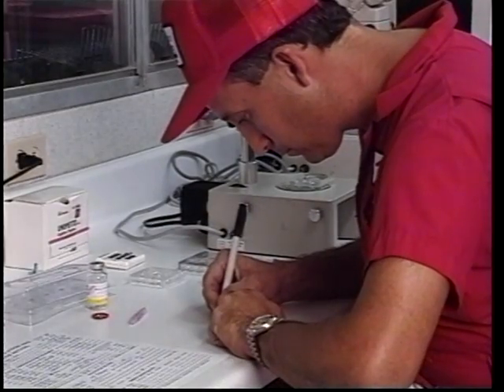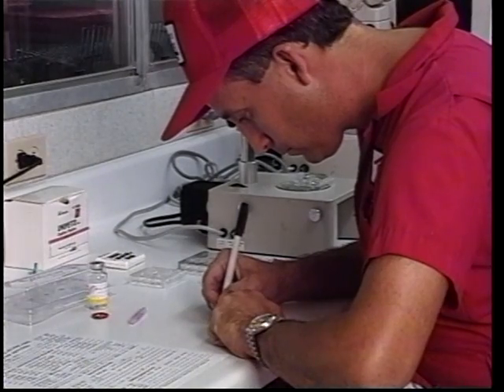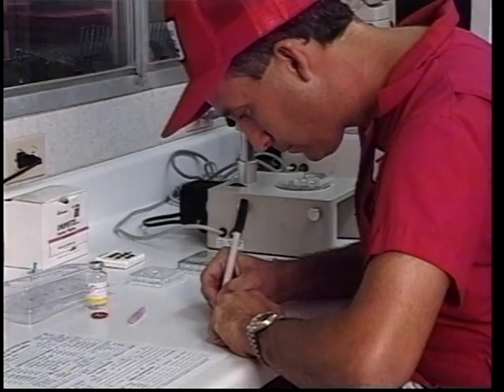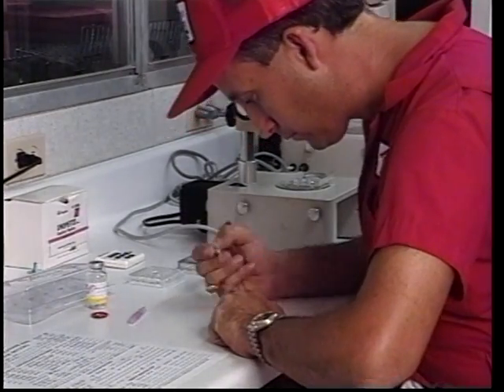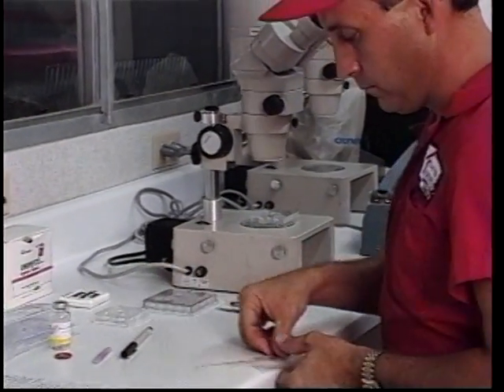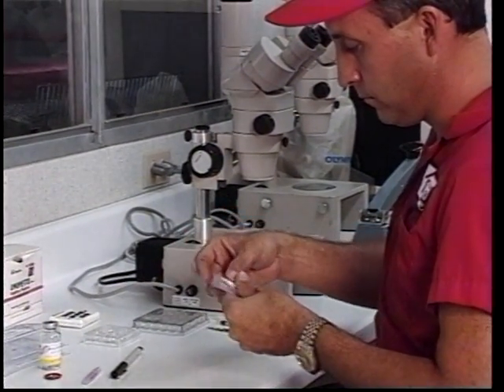All of the writing needs to be done on the cotton plug end of the straw, and on the back side, write the embryo freeze code, which identifies the particular company doing the freezing, followed by the date. With this information, we can check back upon the records and determine exactly which embryo was frozen in each straw.